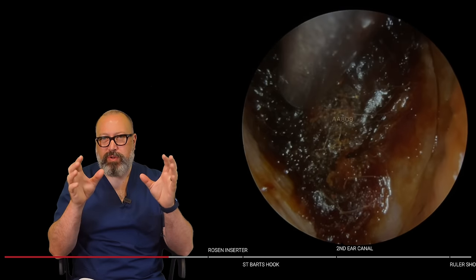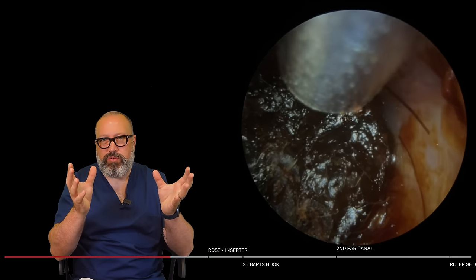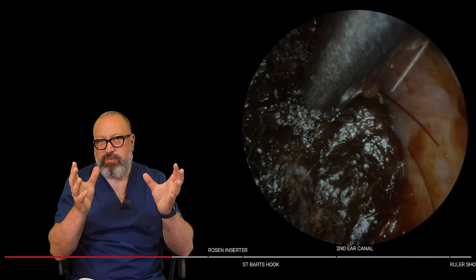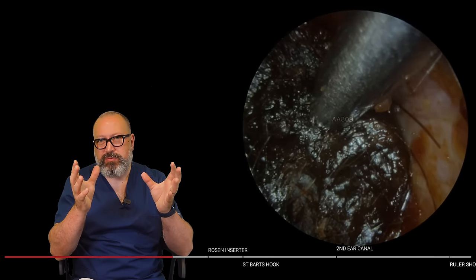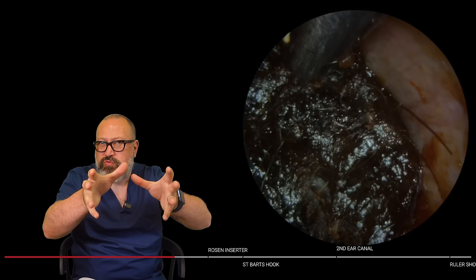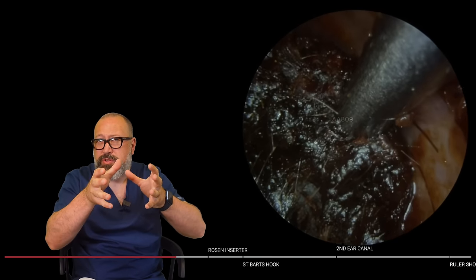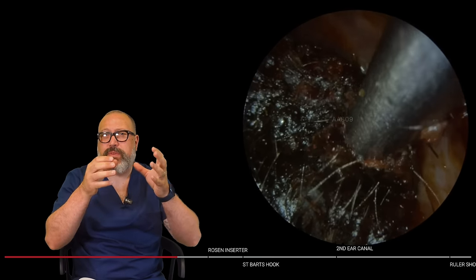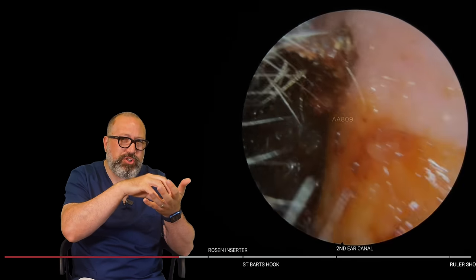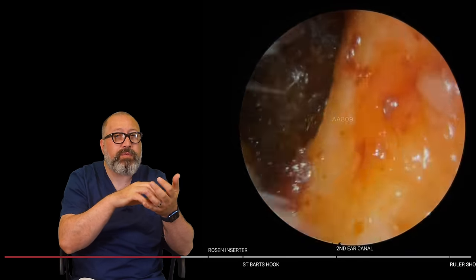Now this is more awkward. Now we're deeper and it's perfectly formed to the canal walls all the way around. So not the easiest one to move at this point. I'm just trying to hold on to a section and not so much pull out, but just draw it away from the eardrum at this point, because it's really, really deep. So you can't go pushing the suction tube into that plug, because we don't want to push it back onto the eardrum, which would be very uncomfortable for our patient.